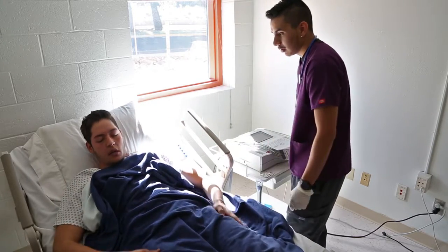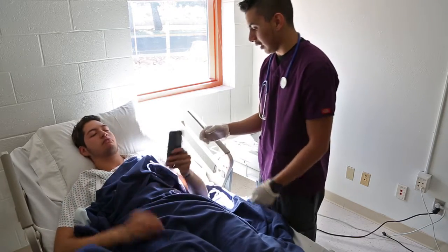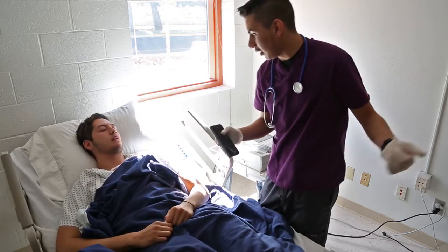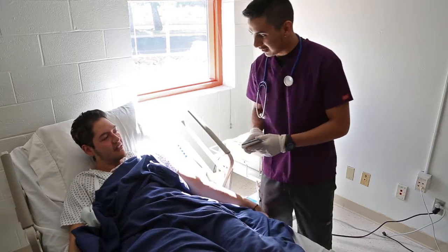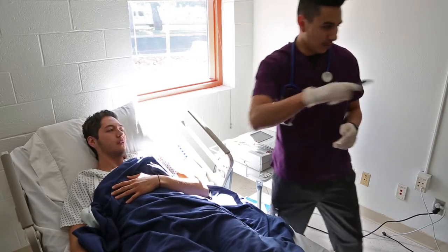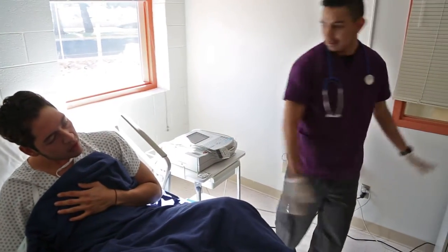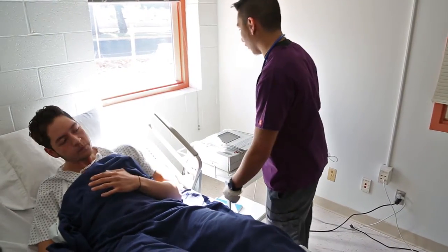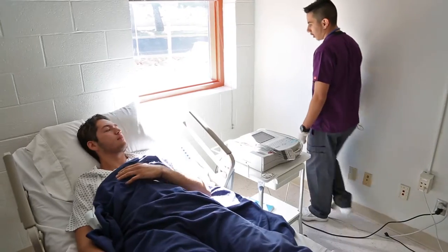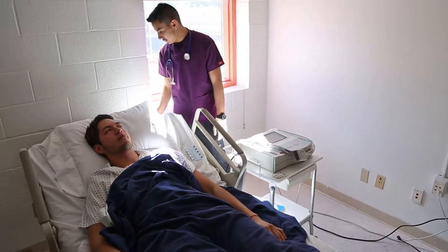The patient has a cell phone — I'm going to be placing it over here next to our printer so it won't interfere with the electricity from the machine. I'll put it right there where you can see it and give it back to you right when the test is over. I also want to make sure the bed isn't touching the wall, as this could also interfere with the electricity. Seems to be okay.